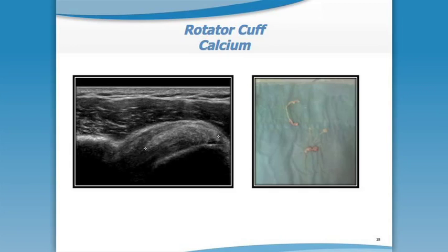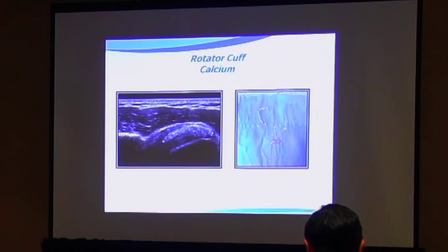Speaking of calcium, percutaneous calcium aspiration under ultrasound guidance is very productive in eliminating patient pain in a non-surgical approach, and frequently what you'll retrieve is this toothpastey type of material. And if you're interested in how that procedure is done, there's a very specific way to lavage that, that not only myself, but I know another person in the room has had great success with doing, and would strongly encourage ultrasound guidance for that non-surgical approach to calcific tendinopathy.